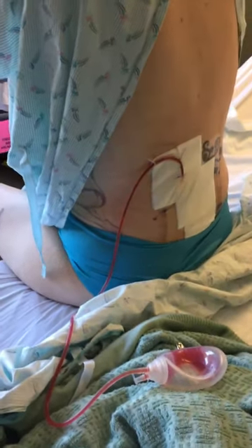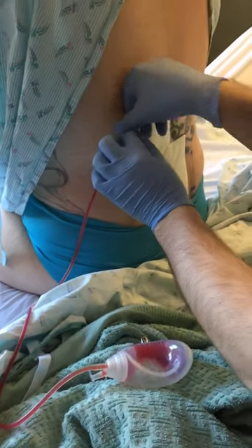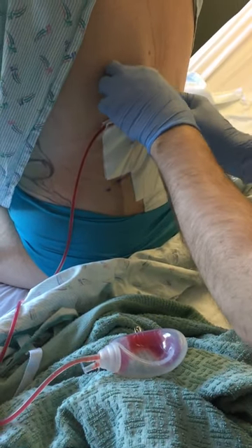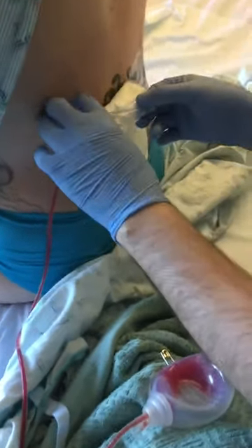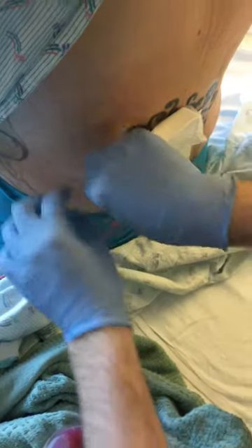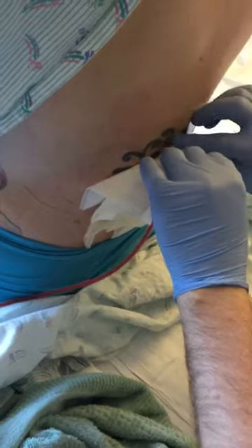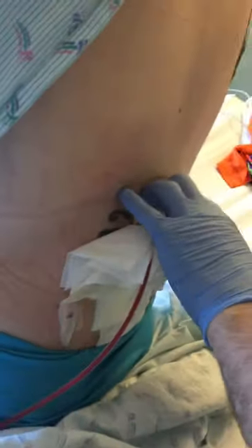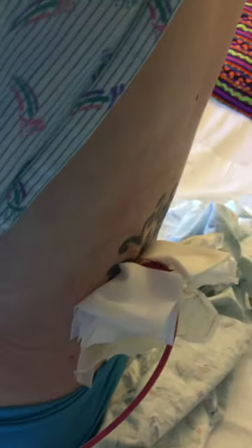All right, I'll go and get it. So here we go — bear with me. I know some of this stuff is pretty sticky, so try to be careful. This Dermis is relatively nice to your skin, but still. Okay — and there's the suture. Okay, perfect. Let me sneak behind you.